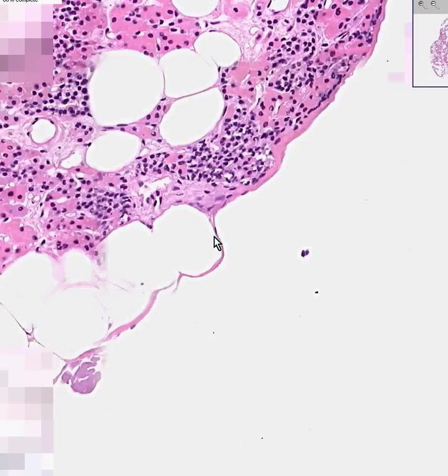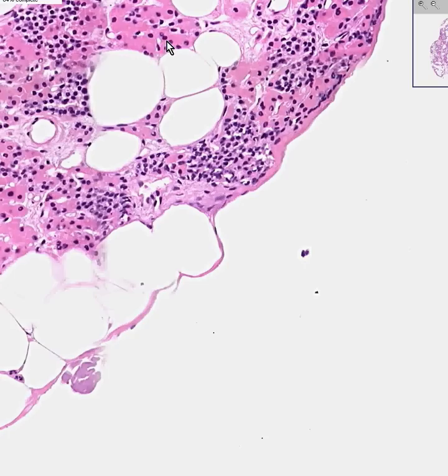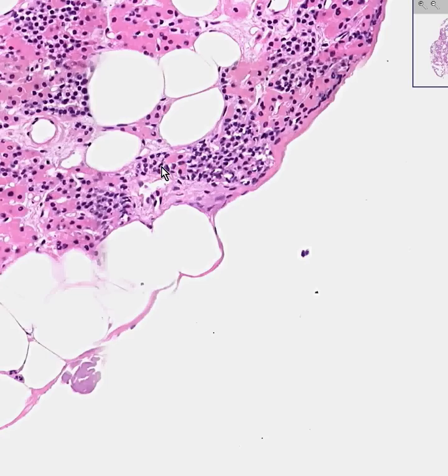All of these cells here are oxyphil cells. And all of these guys at the highest power, looking a little bit more boring, are the chief cells.